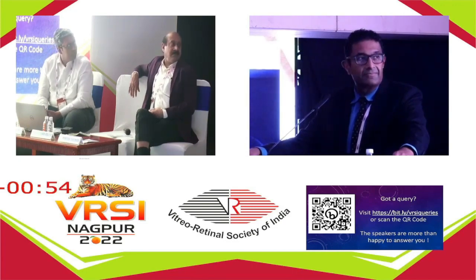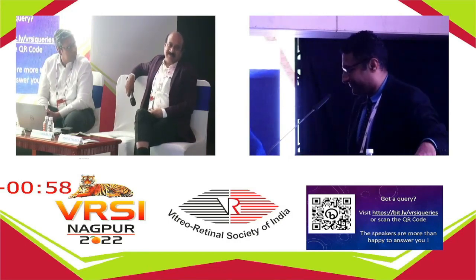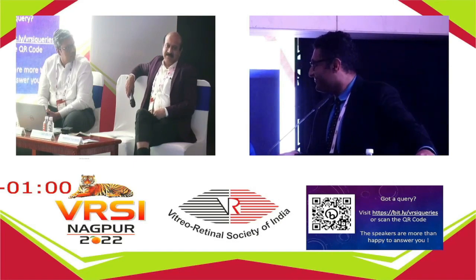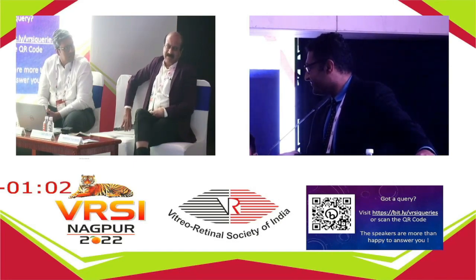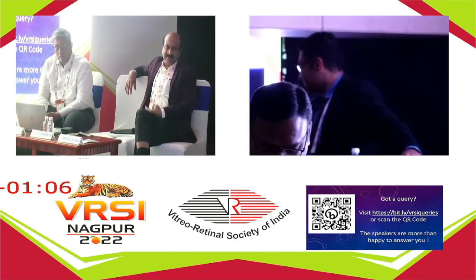I would go slightly against that, because with the help of Heidelberg, if you take the peripheral pictures, that gives a better view with high resolution. And you can actually club those pictures and get a better view of the choroid, rather than having only the ultra-wide field taking the choroidal scan.